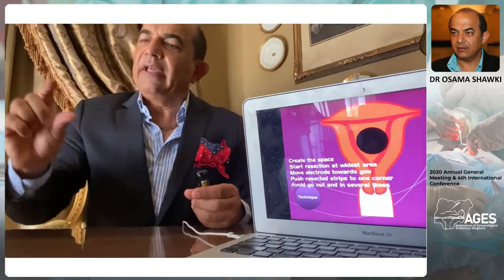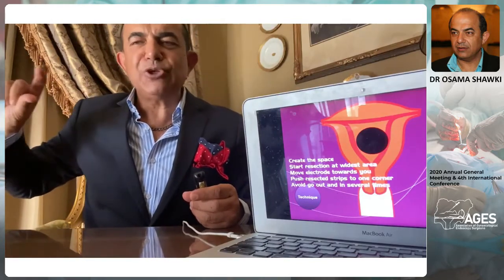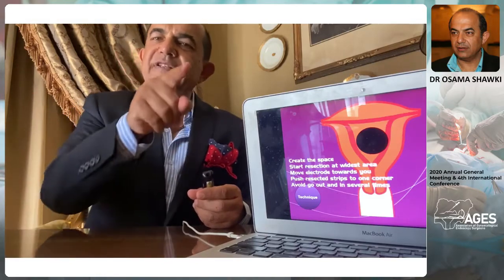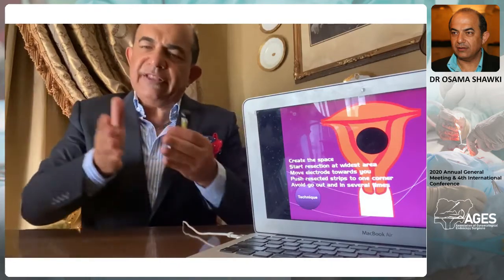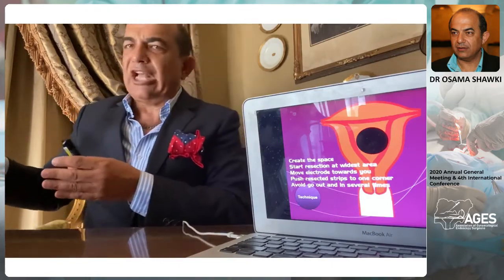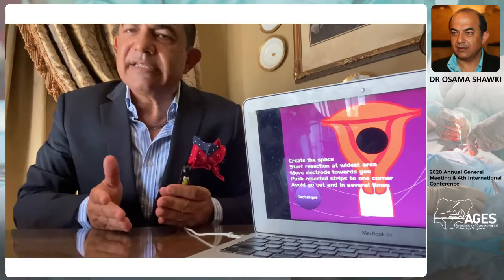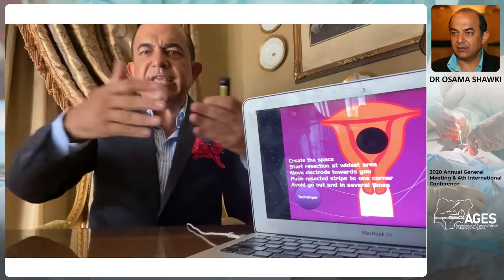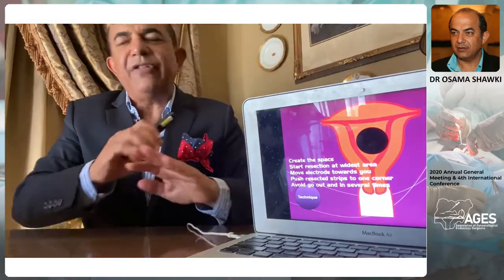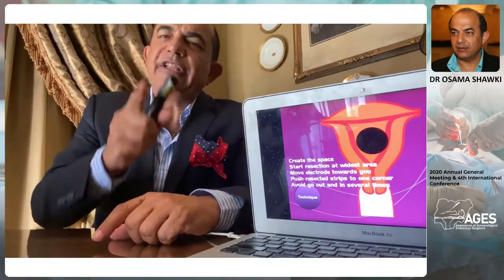And one more important thing that every hysteroscopist should know: the pressure setting shown on the machine or in the pump is absolutely not the same pressure inside the cavity. So for laparoscopy, when the machine says 15, the intra-abdominal pressure is 15. But in hysteroscopy, if the machine says 120, inside the uterus it could be hardly 60 or 70, because the pressure is coming from the machine at 120, but the uterus is leaking a lot, so you cannot actually measure inside. And there is no pump in the market, whatever the technology, that can tell the actual intrauterine pressure.